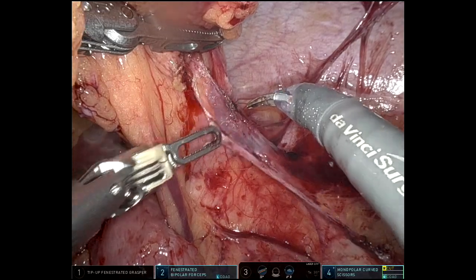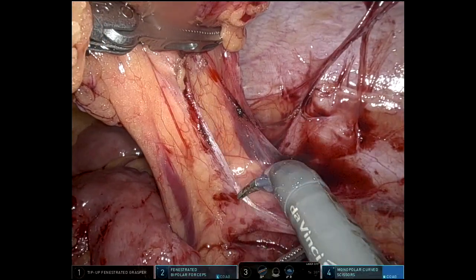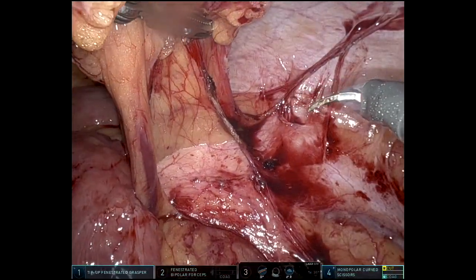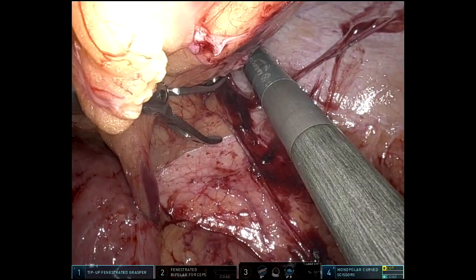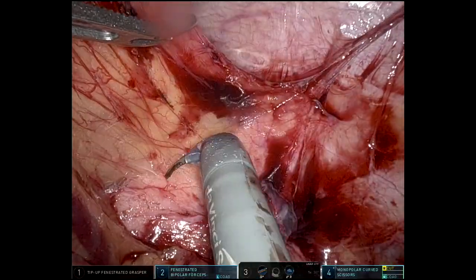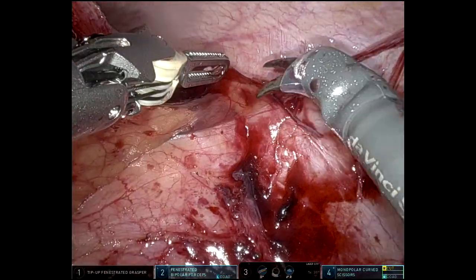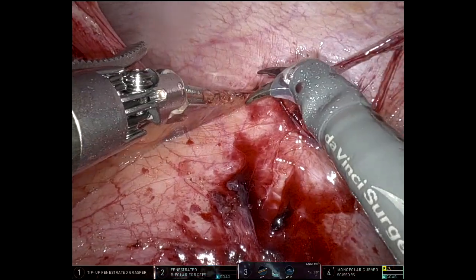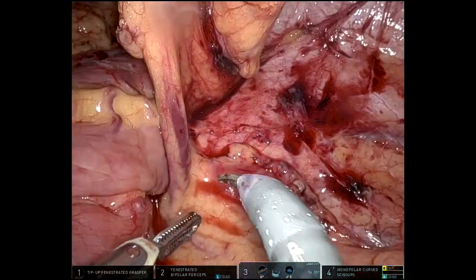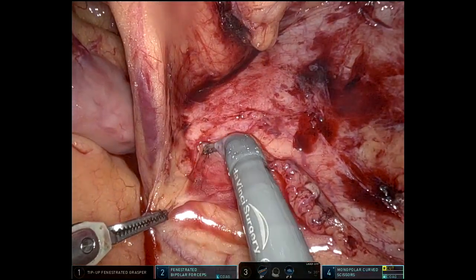Having done a handful of these cases, this one wasn't bad in terms of scar tissue. And especially what was nice about this one — as you'll see — is that the rectal stump was easy to identify and easily mobilized. I'm doing what I can to try to work laterally to mobilize the descending colon up to the splenic flexure. Once I get to the point where I can no longer do any more mobilization because of that colostomy in the way, then I'll go about taking down the colostomy before performing the splenic flexure mobilization.